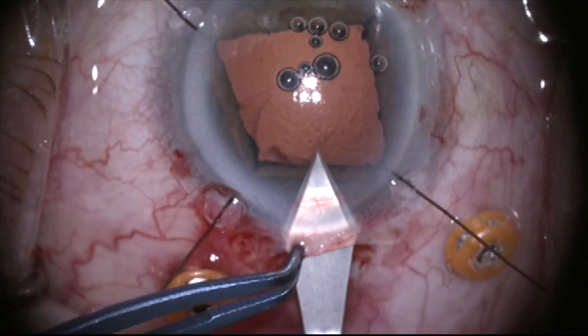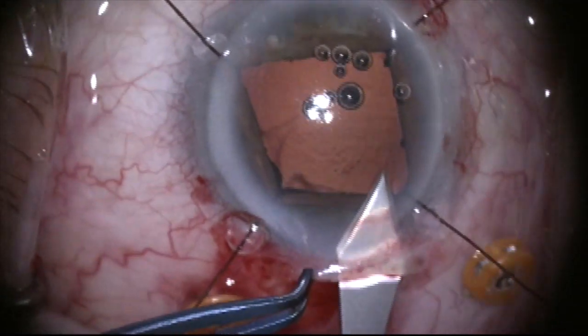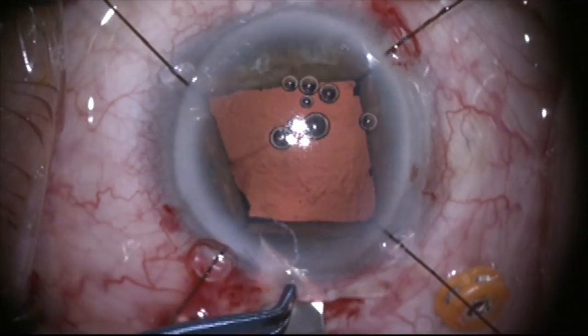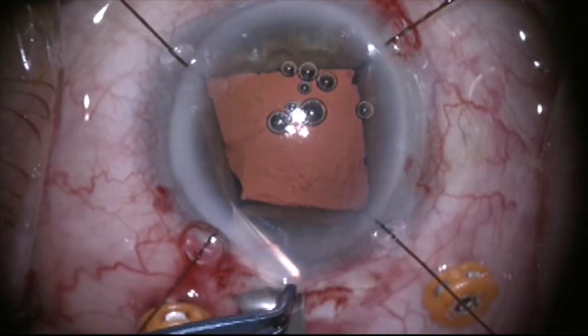Here I'm making a scleral tunnel 6mm wide after placing iris retractors and some trocars. I need this incision to be self-sealing so I'll have control of the eye. I'm now viewing through the Biom posterior segment illumination system and I can see the edge of the lens. This eye has already been vitrectomized.